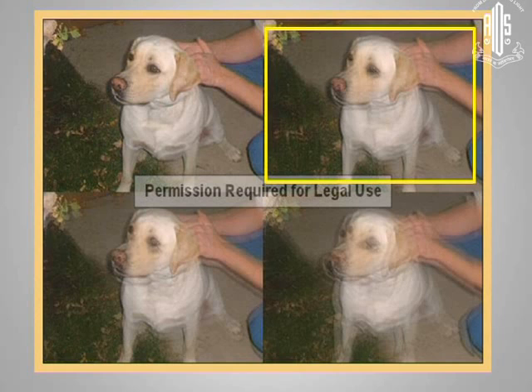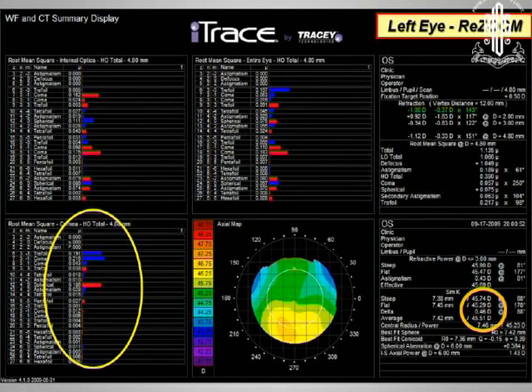And so he found on the internet this sort of thing where you can show your doctor the problem with your vision. And he circled this photo off of this internet tool. This is what I'm seeing. Well, let's look at his wavefront. So this is the total eye. He doesn't have much in the way of cylinder. That's the far right. And you see here he's got some aberrations from the cornea.